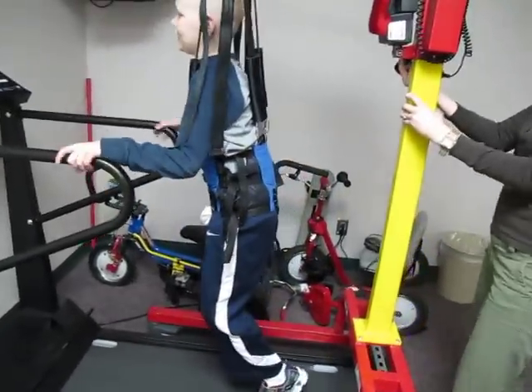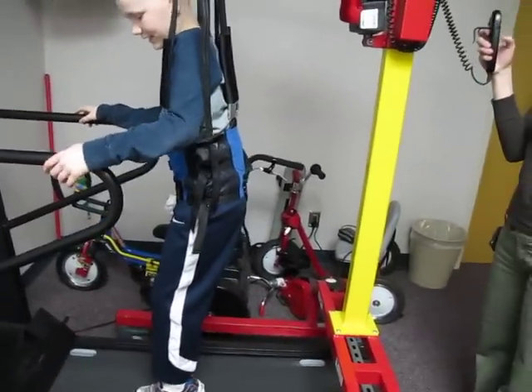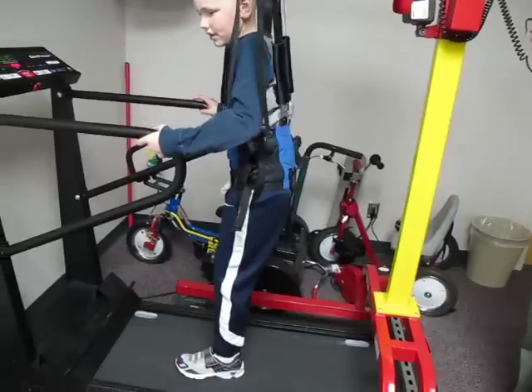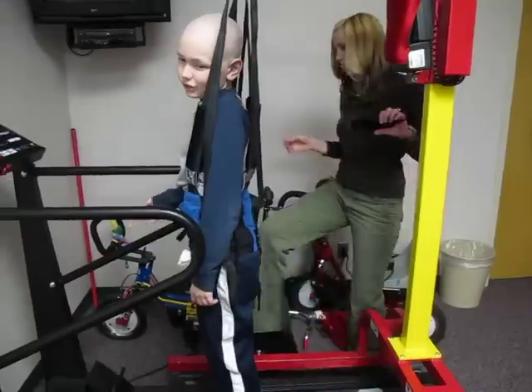You okay? It's kind of a funny feeling at first. Now how much are you standing? Am I holding you up quite a bit? Yeah, quite a bit. Put your foot right there, perfect. How's that feel? Good. You feel like you got about half your weight on your foot? Yeah, not all the way? Pretty much all the way.